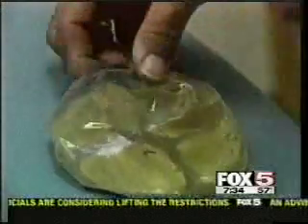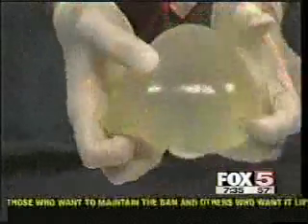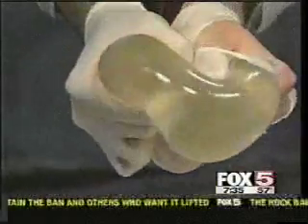What they're talking about today is these folks are going in front of the FDA panel to see if they can have unrestricted use for primary breast augmentations, folks that want to be more shapely, be a little more in proportion.